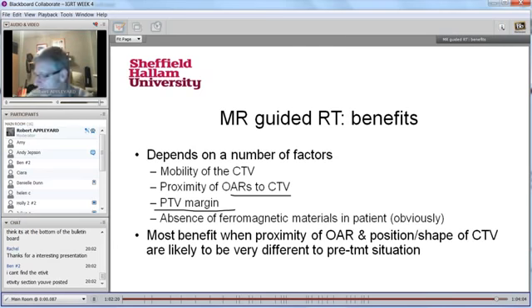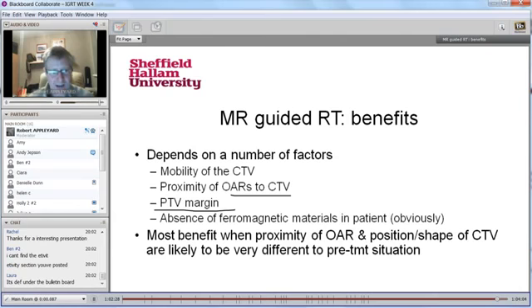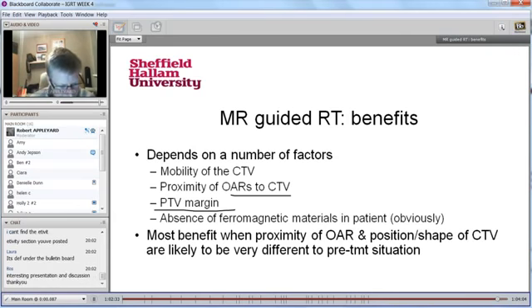MR treatment units. These are sort of the now of what tomotherapy was a few years ago. So now we're looking at whether these are a good solution. But yeah, Laura says it's definitely there. So if you go to the bulletin board page and scroll down, there's a picture under there that has everything that you'll need. But thank you for participating tonight, people.